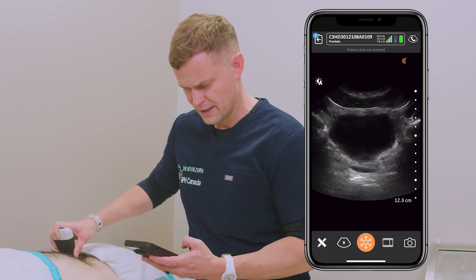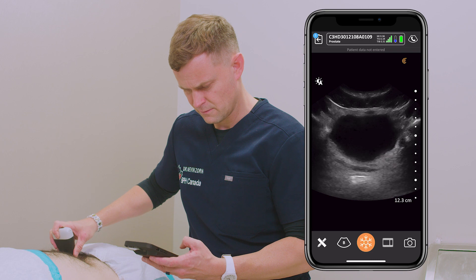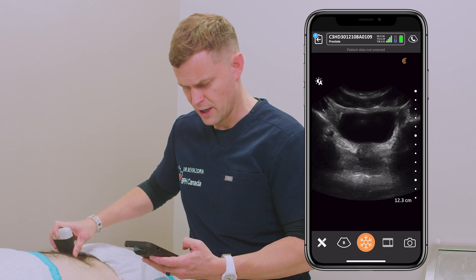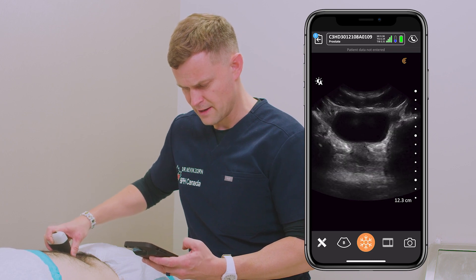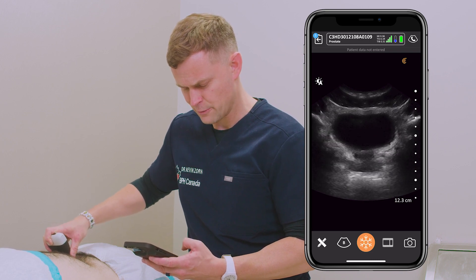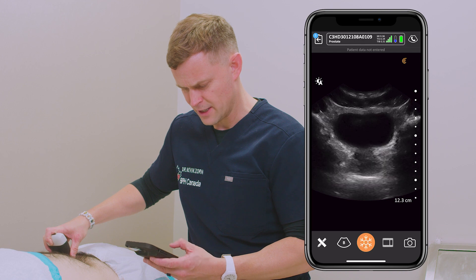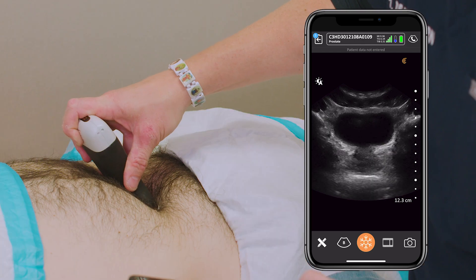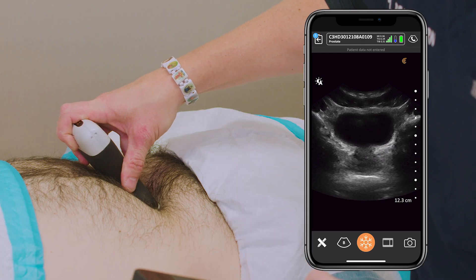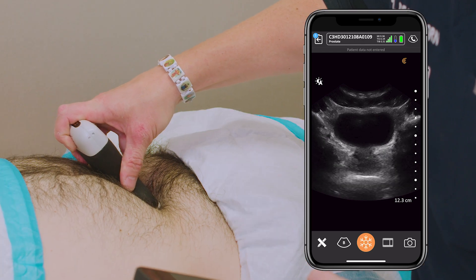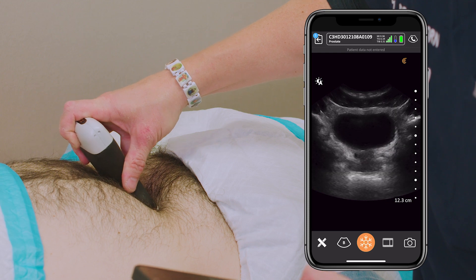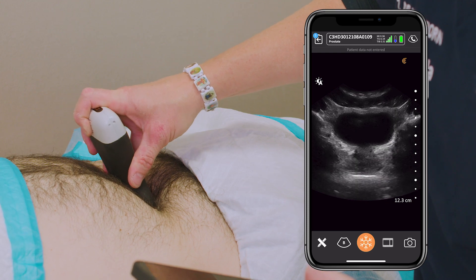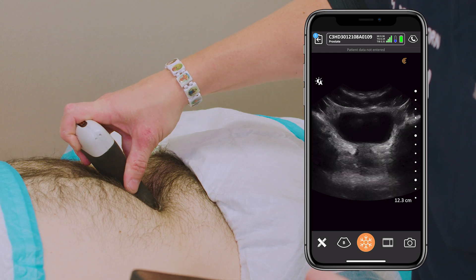I'm going to fan it out and I can zoom in. There are the seminal vesicles — the little bunny ears behind the prostate. Those are normal, and as I fan downward there's our prostate. Just getting an idea of the echogenicity — are there any hypoechoic areas or calcifications, suggestive of inflammation or chronic inflammation?